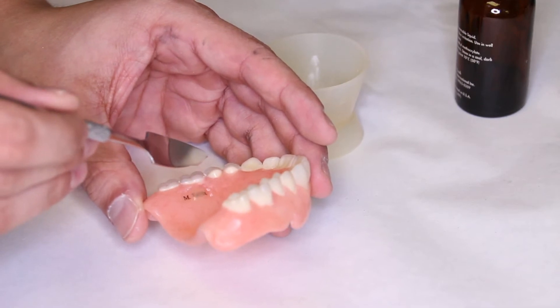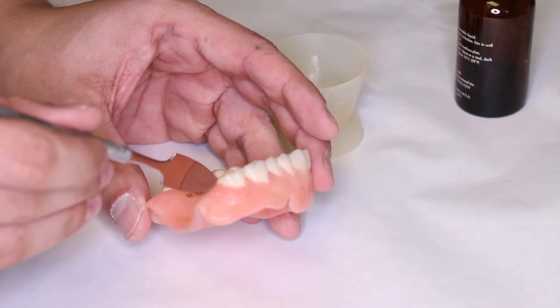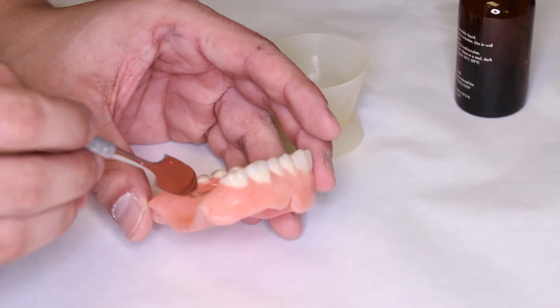Once the proper consistency has been reached, you can then apply the clear acrylic over the tag, making sure that it completely encompasses the tag within the denture.